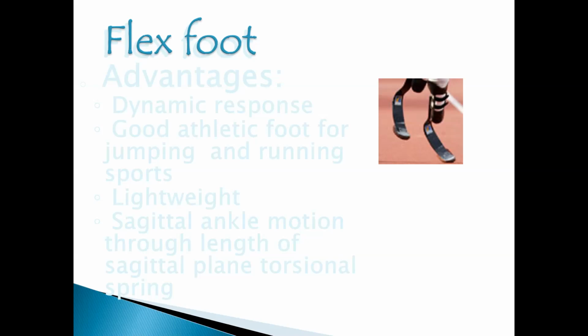The first time he qualified, there was some objection under the idea that maybe his prosthetic legs gave him an advantage over people with sound legs and feet, which is actually preposterous for reasons that I'll describe if you're really interested. But then after being disqualified the first time, they took those questions to biomechanists and other experts and they said, no, they're really cool, but they're not as good for running and sprinting as sound limbs and feet. So he actually competed with legs that are kind of like this in an actual Olympics.